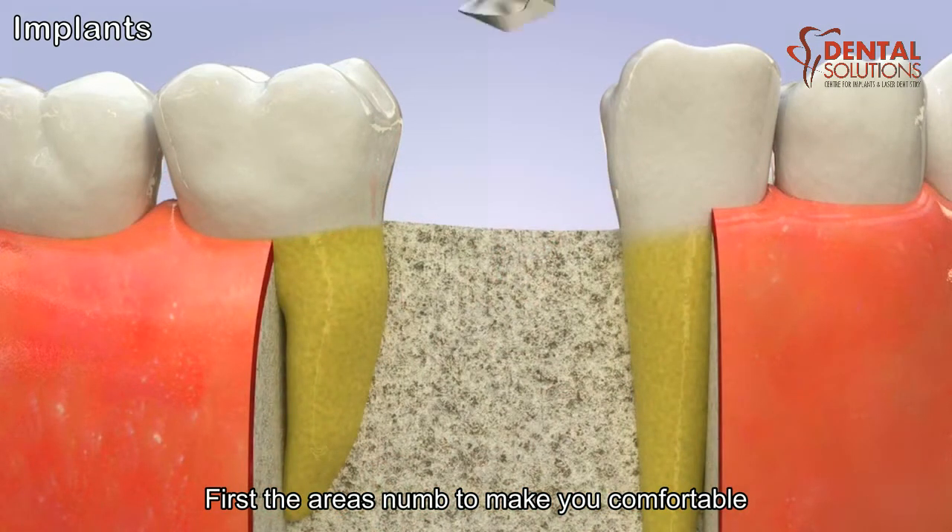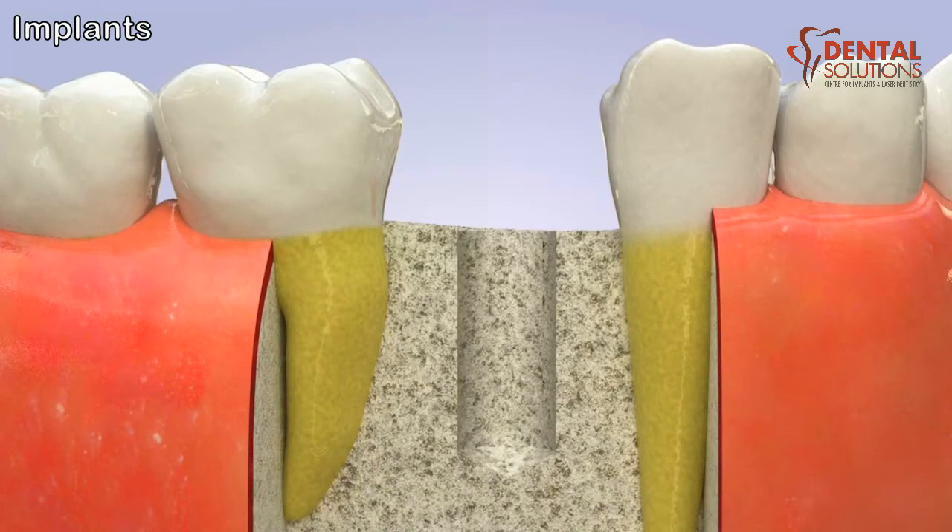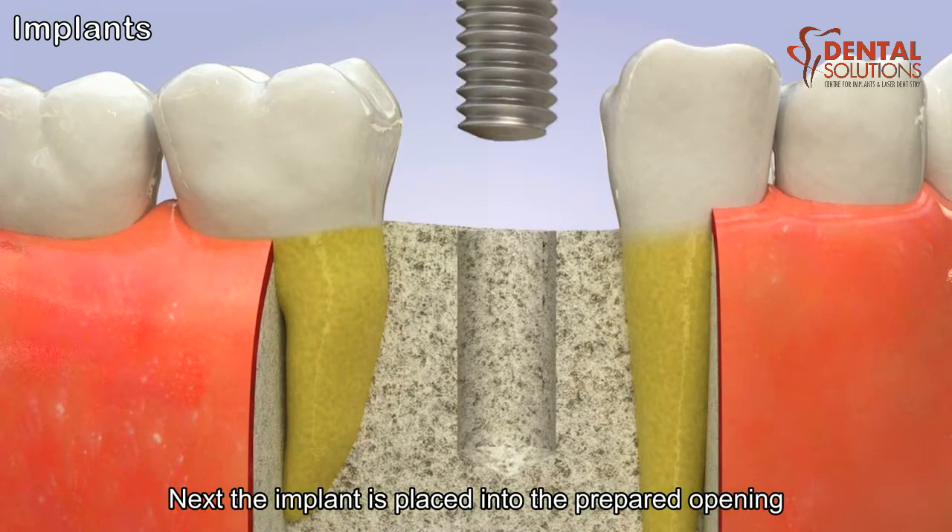First, the area is numbed to make you comfortable. Then the doctor will make an opening in the bone for the implant. Next, the implant is placed into the prepared opening.